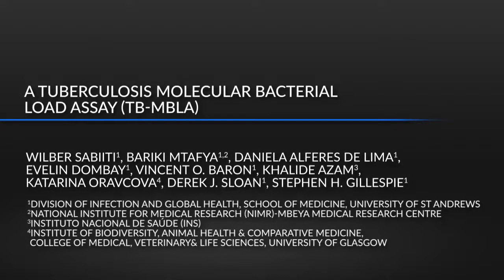This tuberculosis molecular bacterial load assay answers 3 key questions. 1. What is the magnitude of the patient's disease burden? 2. How does the patient's disease burden respond to the antituberculosis medication? And 3. What is the relationship between disease burden and treatment response?